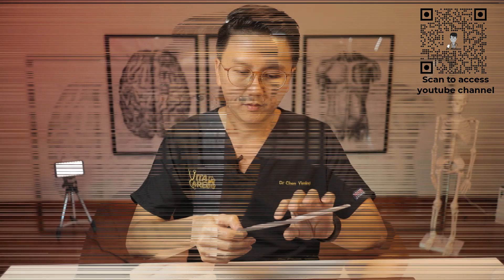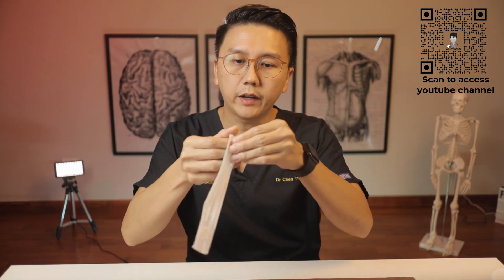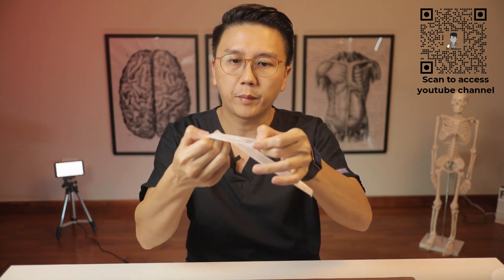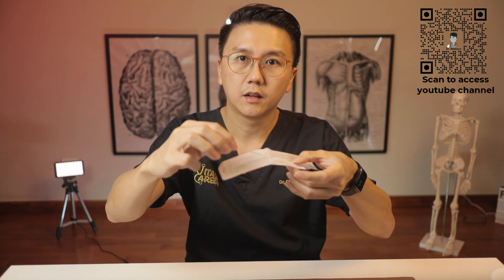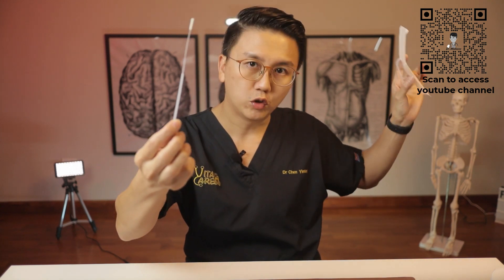Remove the stick ensuring that you do not touch the soft part of the swab. Remove the stick from the end without the cotton. Throw the package away.